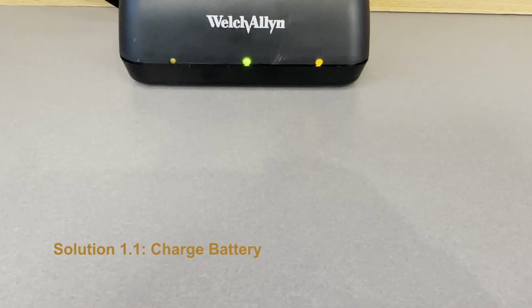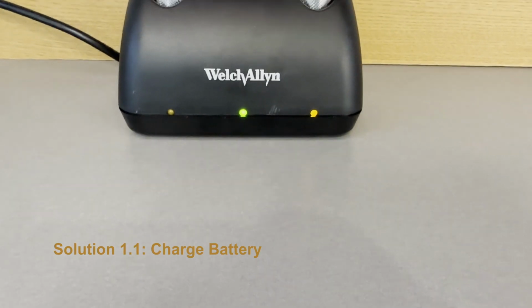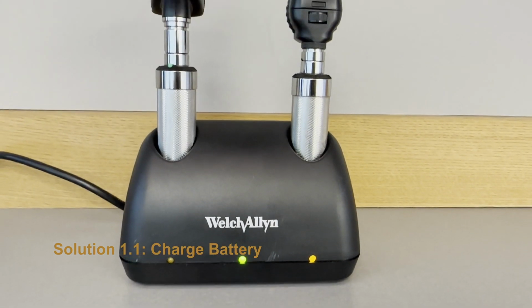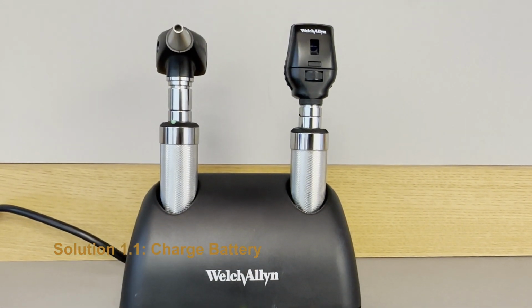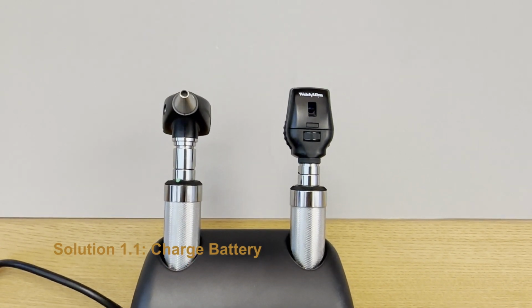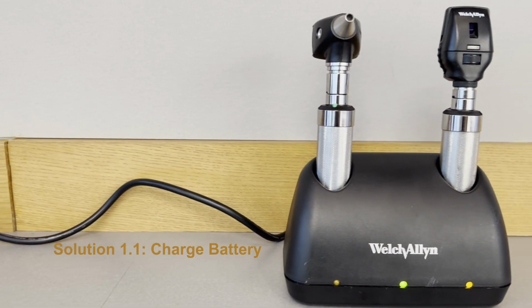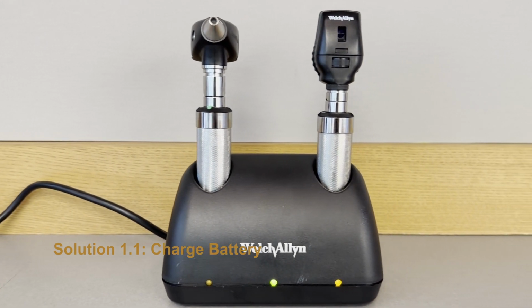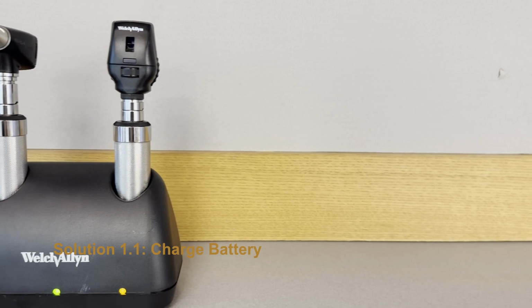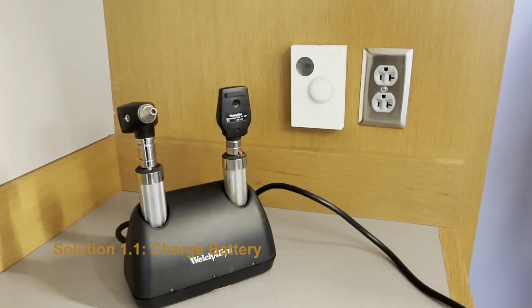If there's no light, it's possible that the battery is not charged. For scopes with reusable batteries, place the scope in the base, which serves to store the scope and recharge the battery. Check the color of the light on the base. If it's green, the battery is charged. If it's orange, let the battery charge until the light turns green. If there's no light, check that the charger is plugged into a working wall outlet.